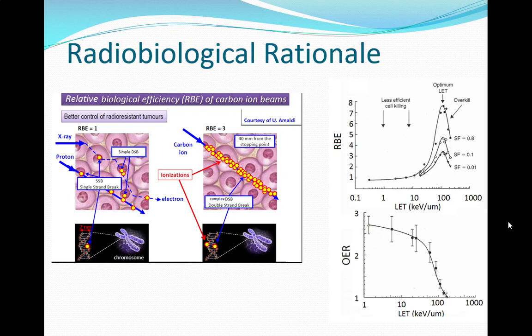They smash into stuff. It has nothing to do with the electrons. You might get some, that's just an added bonus, but basically you're firing a cannonball, and really the ion you're passing in is going to do it. The heavier the ion you shoot, the more damage it does. This is why a lot of people want to move to helium and carbon. Japan has like 6 carbon centers. Because when they start doing it, with a carbon ion coming in, there are just tons of damage.